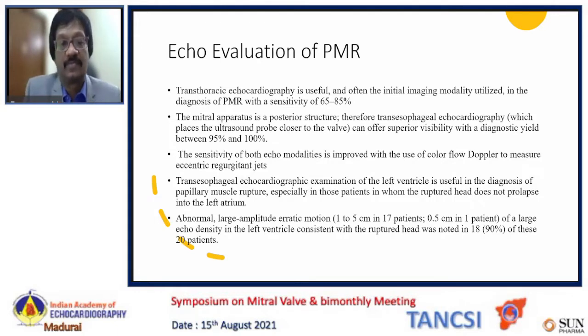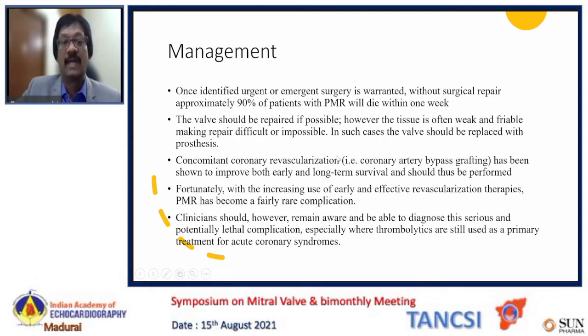And you can see the highly mobile mass in the LV moving into the left atrium, which can be easily appreciated by this transgastric view. So this large amplitude erratic motion of this mass will be easily seen by esophageal echo. For management, we all know that emergency mitral valve replacement is the treatment. It should be done as early as possible. We can do ECMO and Impella support if available while the patient is waiting for surgical replacement.